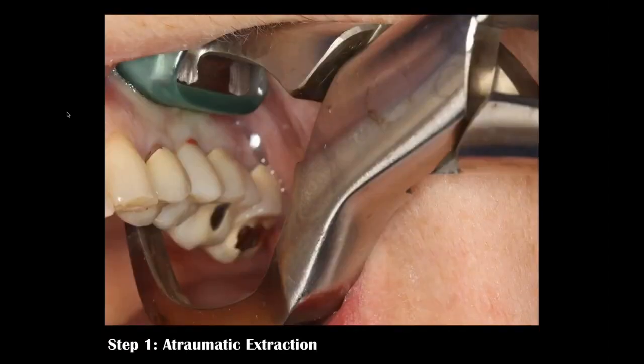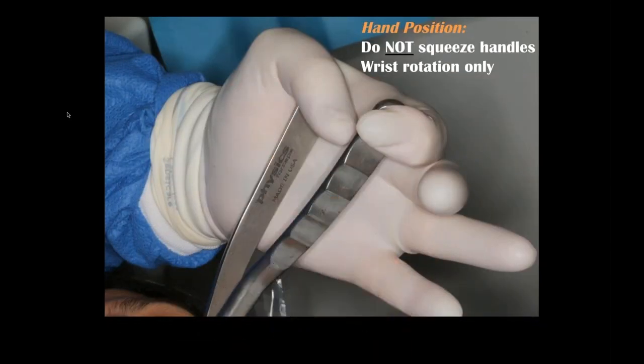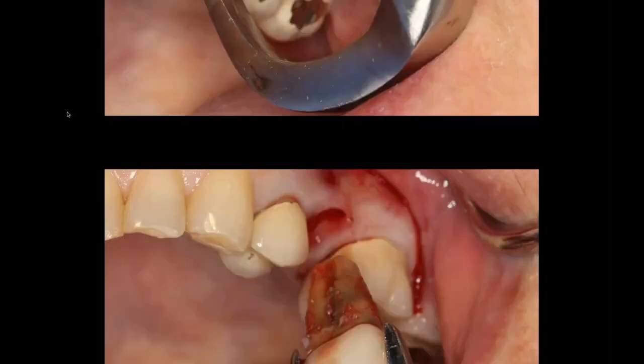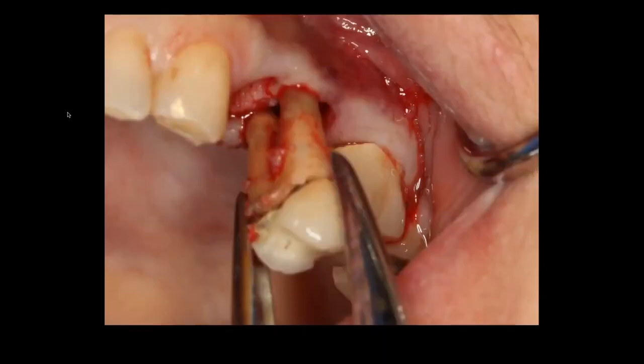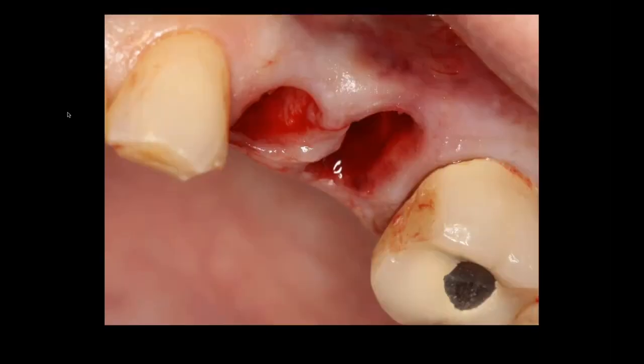Using the physics forceps, engaging the beak on the palatal aspect of the teeth, rotating the wrist towards the corner of the left eye — not squeezing, simply wrist rotation. The teeth will luxate up and out of the sockets and we use a tooth delivery instrument to remove them very efficiently in a matter of minutes.